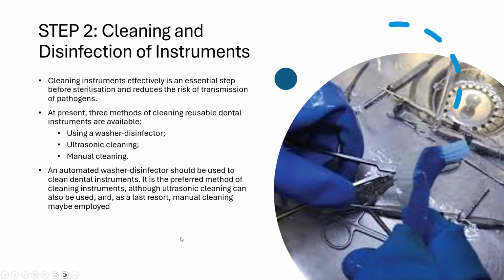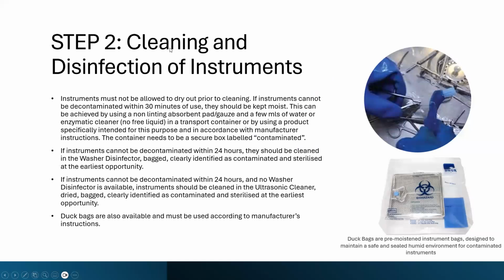An automated washer disinfector should be used to clean dental instruments. It is the preferred method of cleaning instruments, although ultrasonic cleaning can also be used, and as a last resort, manual cleaning may be employed. We are discussing cleaning and disinfection of instruments, the step 2.